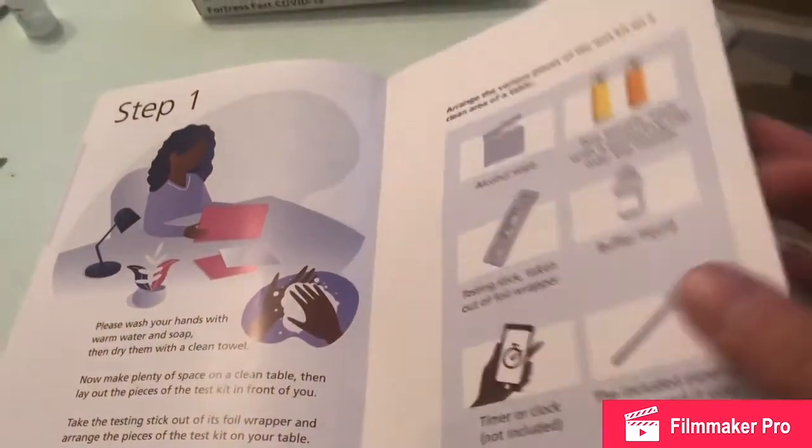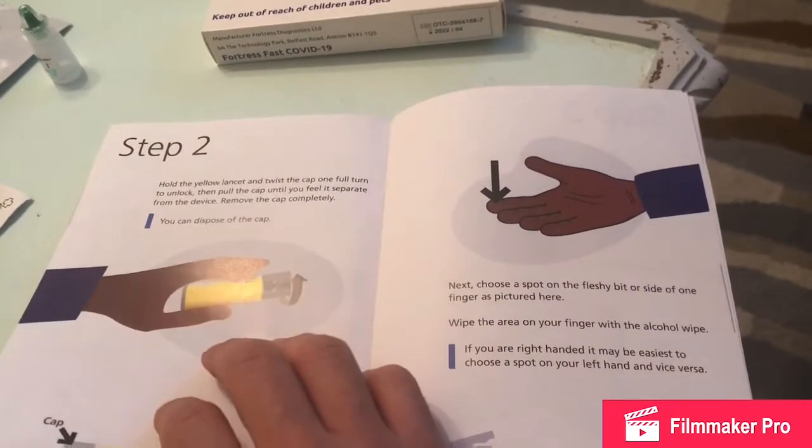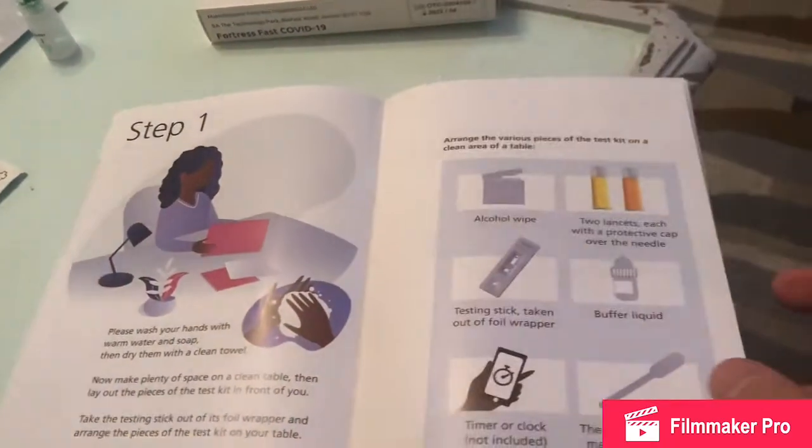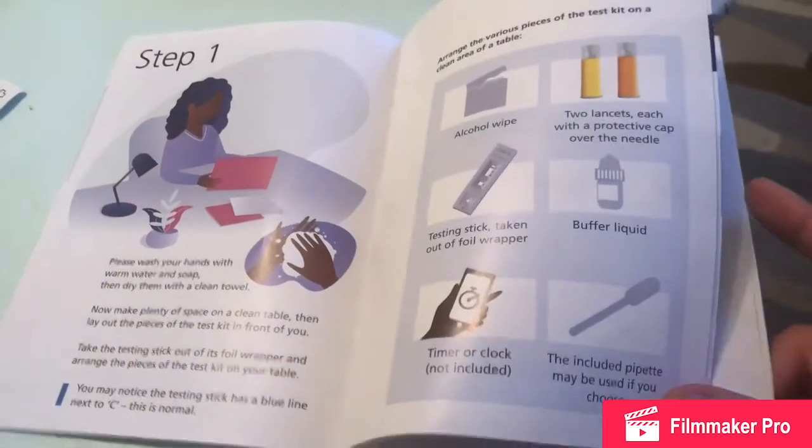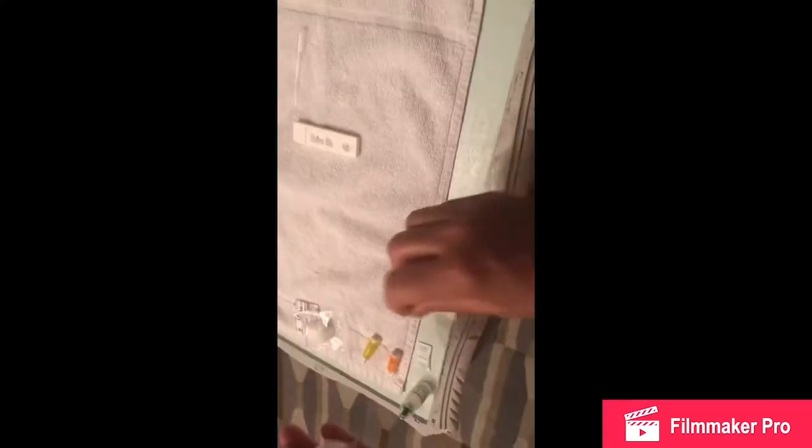We are going to have a read of this quickly — there are a lot of steps here that you need to follow, as you can see — and then we will begin and show you guys how this is done.